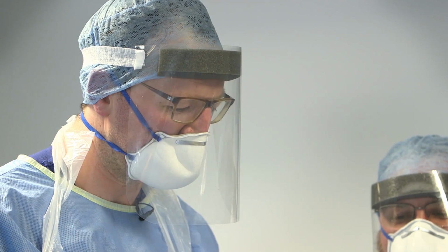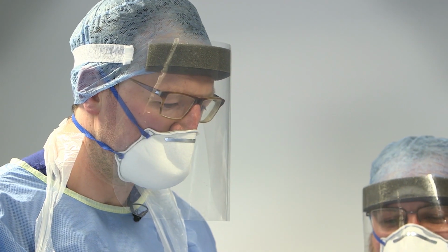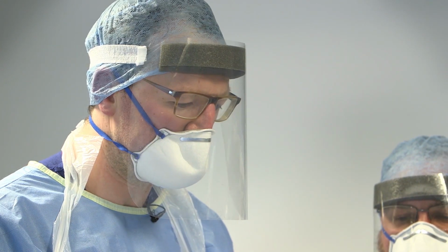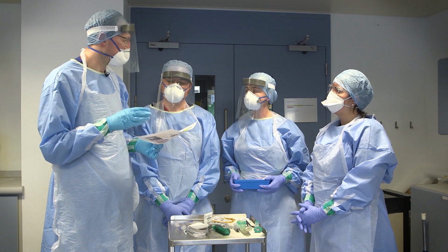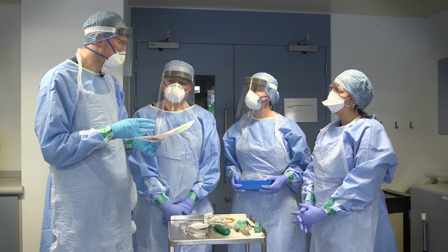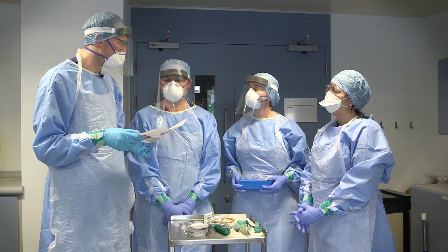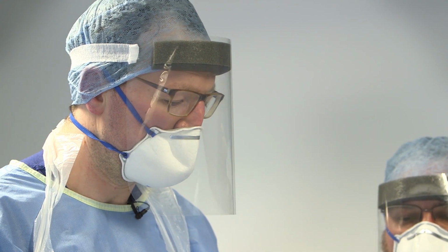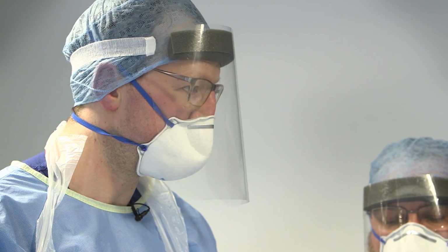Okay, so we're going to move on to the airway plan. So we're going to give the induction agent and rocuronium together, Tori. And I will be holding the face mask on as pre-oxygenation, and I'll be avoiding face mask ventilation during that time. Plan A will be a tracheal intubation with a video laryngoscope, and I'm going to use a bougie.